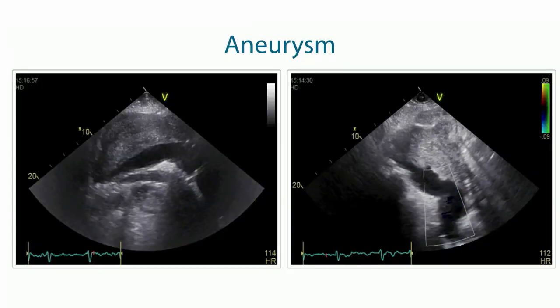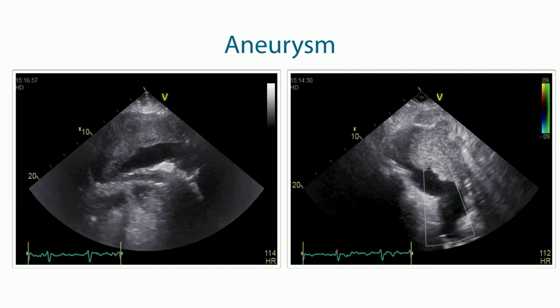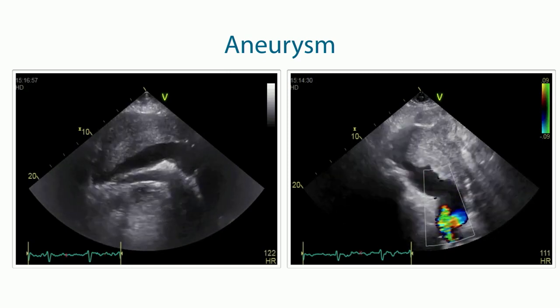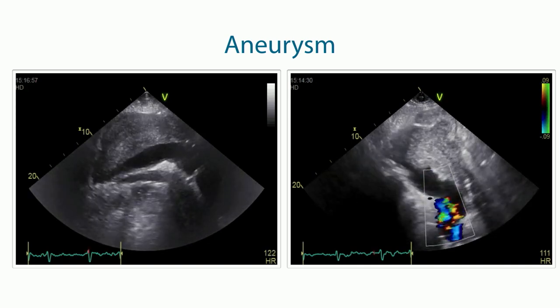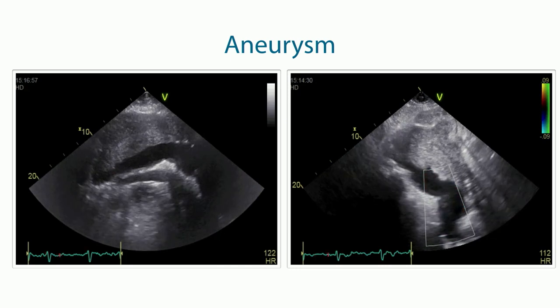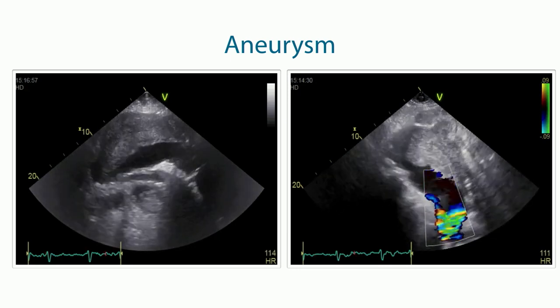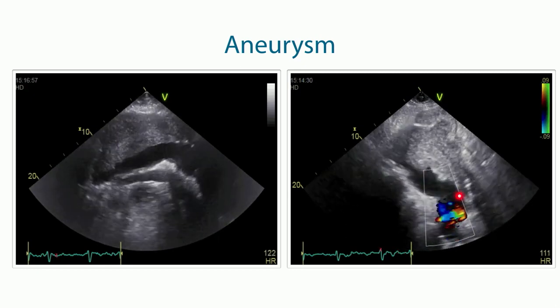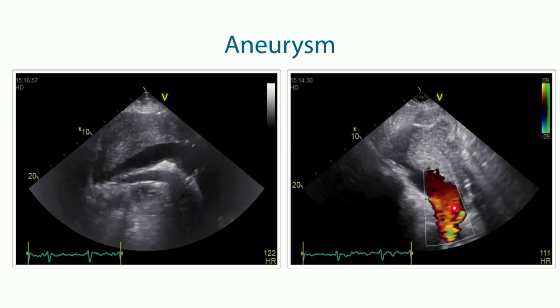this pathology. And here's another patient, a patient who was actually on the ward because he had a myocardial infarction. And when we moved the transducer to the abdomen, we saw that there's a huge aneurysm. As a matter of fact, a part of the aorta was filled with thrombotic masses. In general, always look at the pulsatility of the structure, because the strong pulsatility indicates that it is the aorta. You should not mix up the aorta with the IVC.